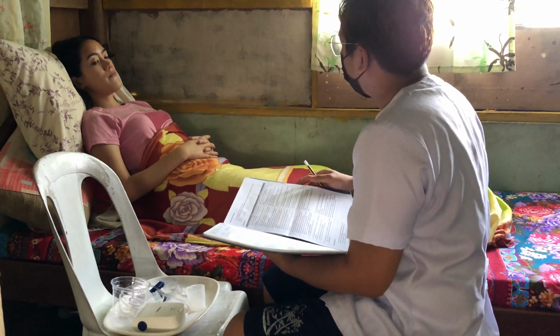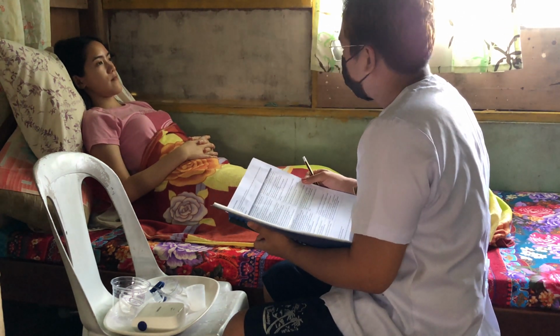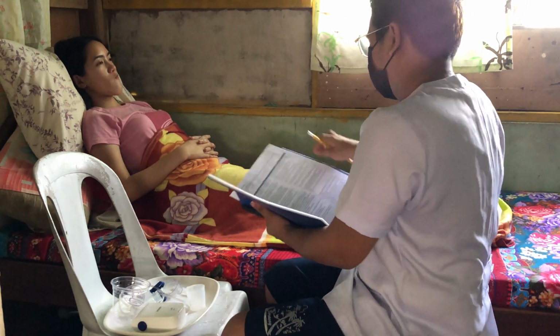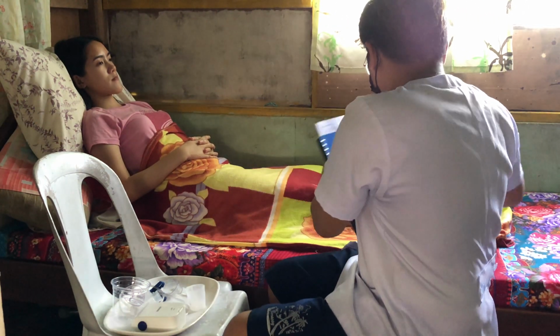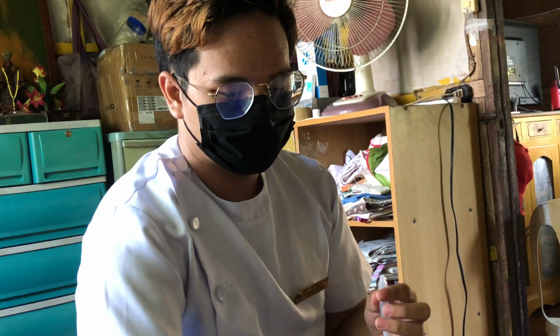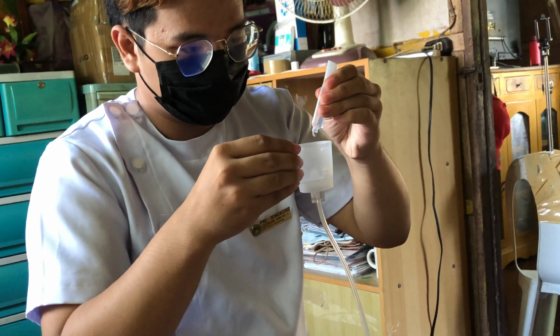Identify the patient by checking the name and identification on the patient's identification band or ask the patient to state his or her name. Explain procedure to the patient to gain cooperation and to allay anxiety. Fill the nebulizer cup with the ordered amount of medication. This ensures that the required medication amount is given.